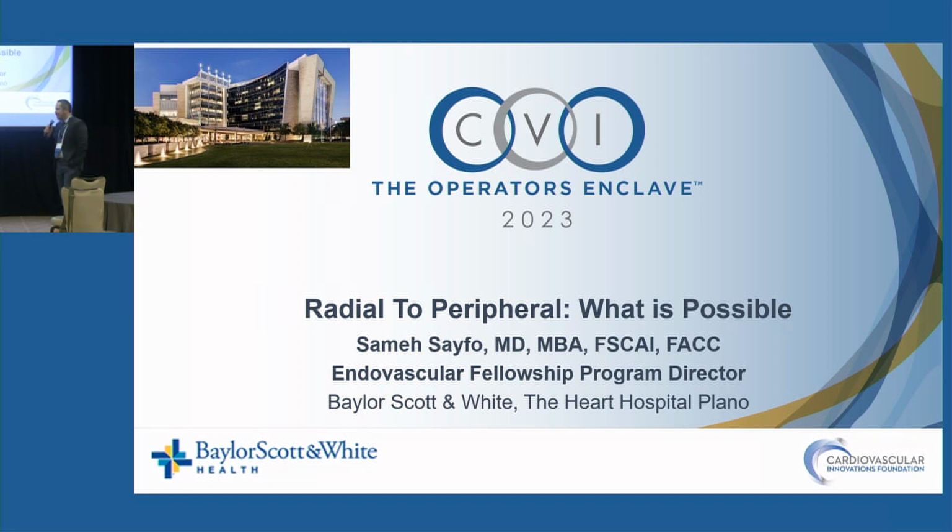Anyway, so I think radial to coronary has been a hot topic for almost 10, 15 years. And if you remember, 10 years ago when radial came to coronary, a lot of operators said, hey, I've been doing femoral for a long, long time. What would I change? And we learned less bleeding, the same success rate, and some benefits. So now I think we're at the same era for radial to peripheral.